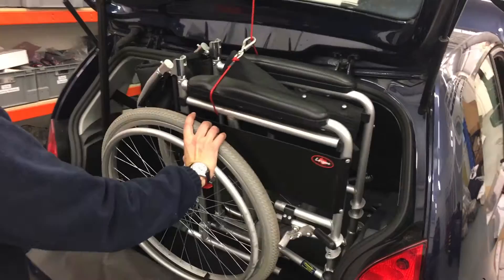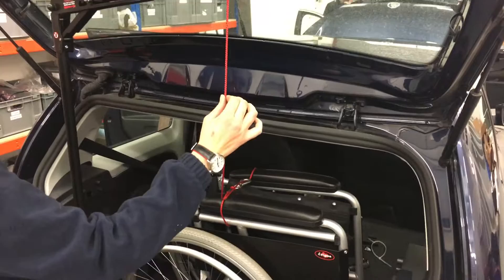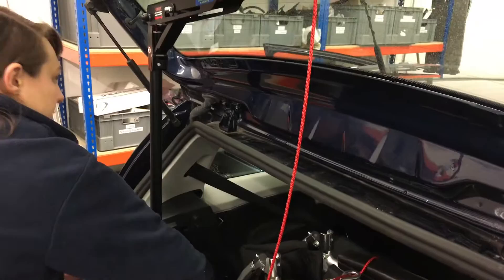Push in slightly to make sure it clears the sill, and then lower the hoist down — lower down enough so you've got enough slack in the rope such that we can refold it into the storage position.